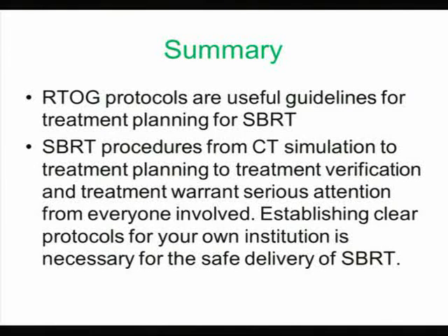And when I check the plan, I also open up those guidelines to see whether every single part is met. The SBRT procedures, from CT simulation to treatment planning to treatment verification and treatment, warrant serious attention from everyone involved. So serious attention means you don't make assumptions.